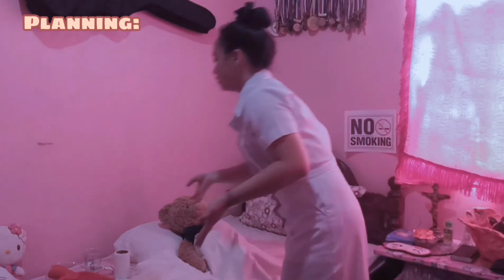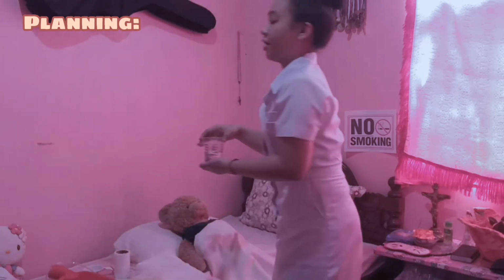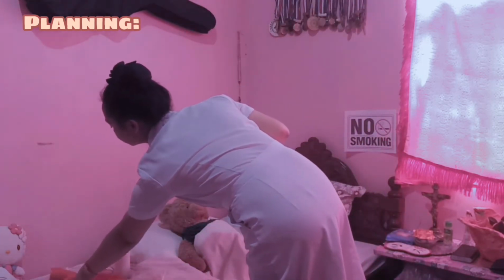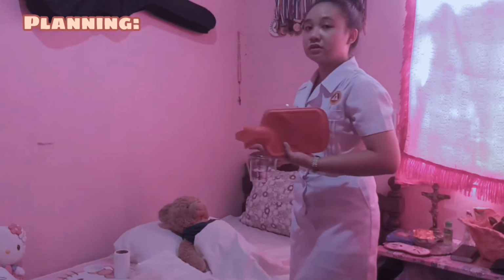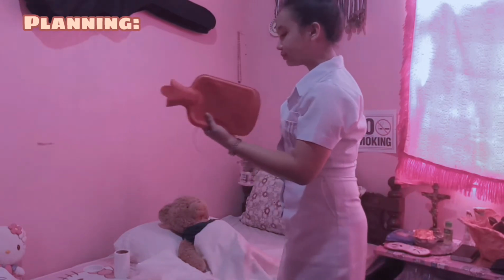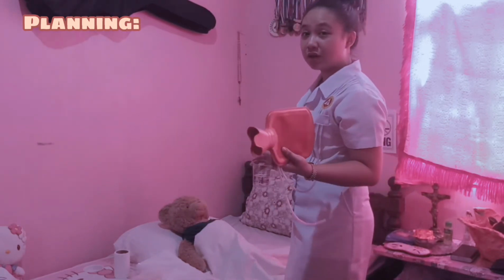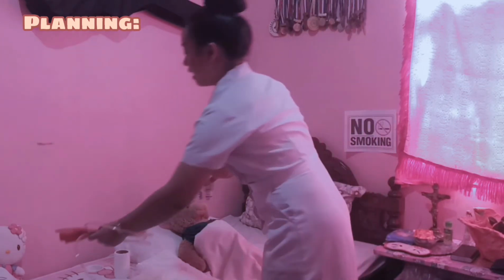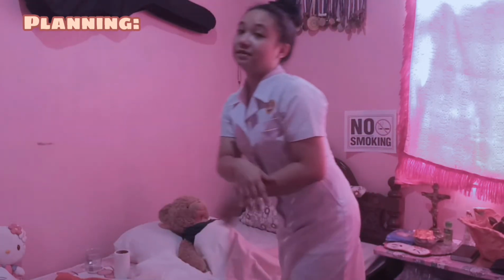And then we have also here the right solution, amount, and temperature of enema, and these are the tools that we are going to use, but this is not the actual material that we need to use for enema, but let's say for instance it is.